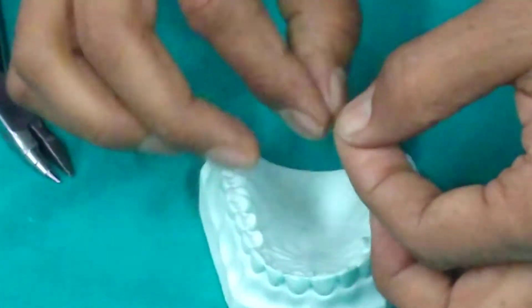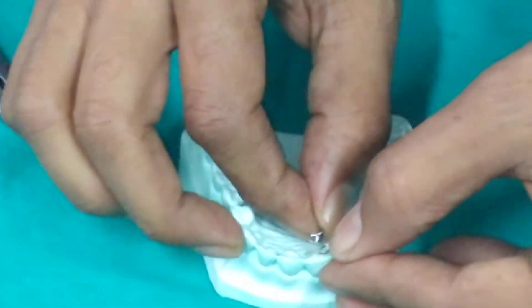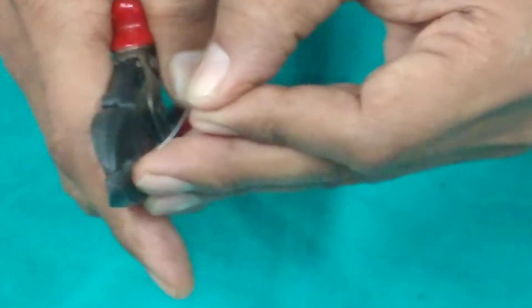This is the retentive arm. We are cutting the retentive arm, which should be approximately 12 mm in length.